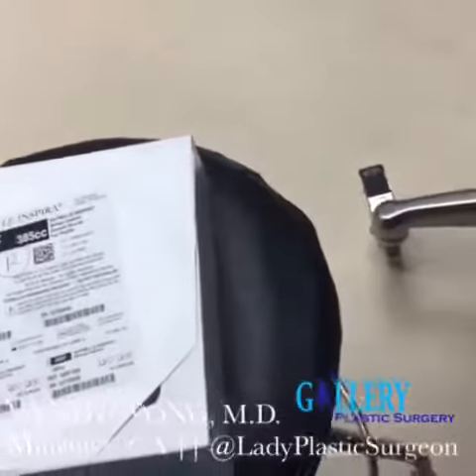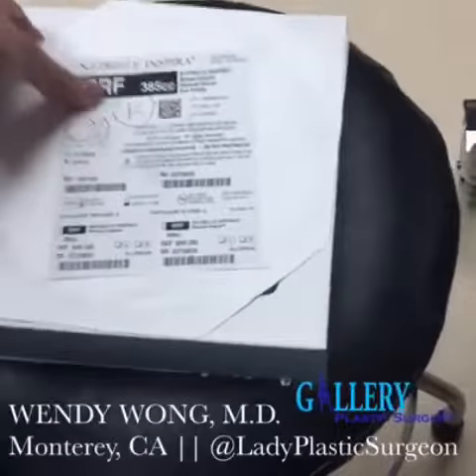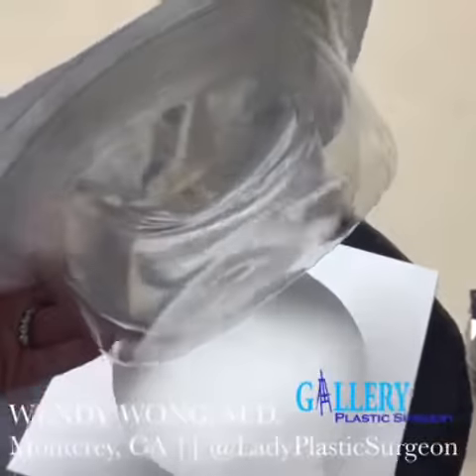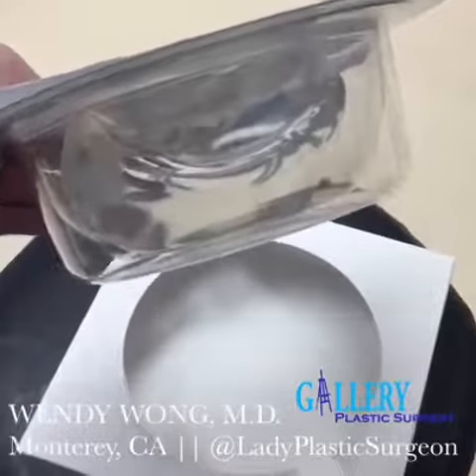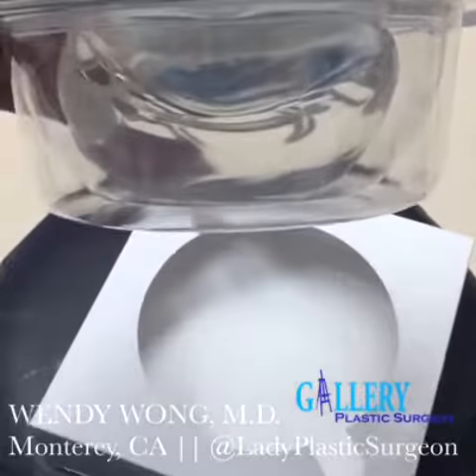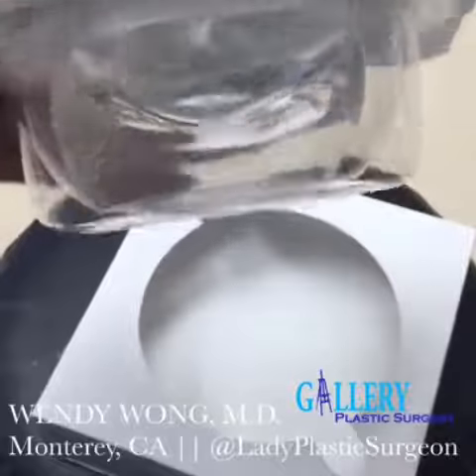Next you've always got your implant — you can see there it is. This is how it comes. It's very sterile, so I'll pass this off to our surgical tech. She's going to irrigate it with a triple antibiotic solution, and I'm going to introduce it into the pocket with a sterile sleeve. There you have it.